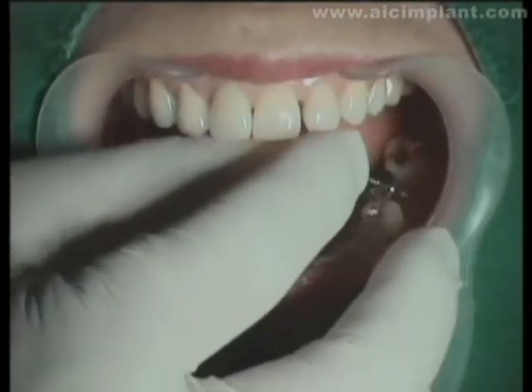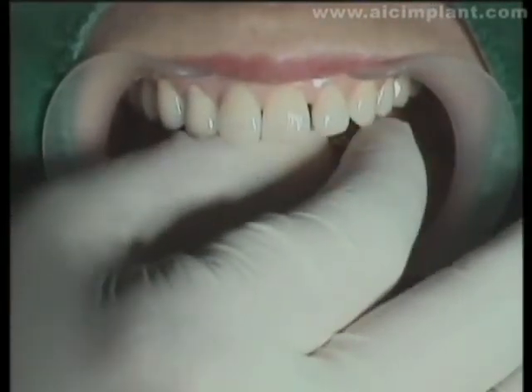We are now connecting the abutment. A rigid abutment is being attached for the GS2 implant. An abutment level impression is taken for a GS rigid abutment or an SS excellent solid abutment. Both are of the cement-retained type. Three decisions must be made when connecting a rigid abutment.